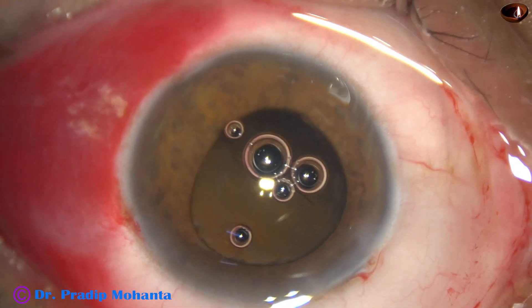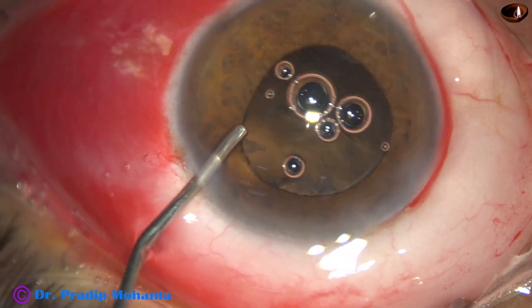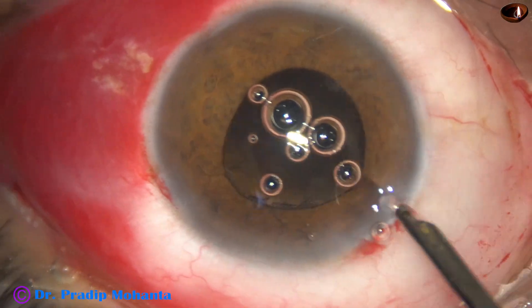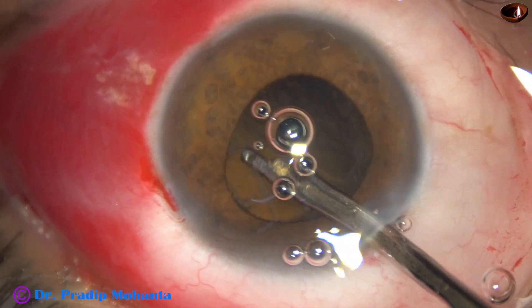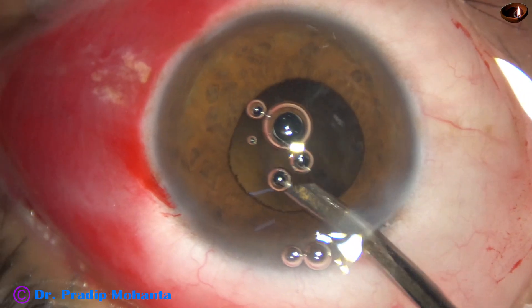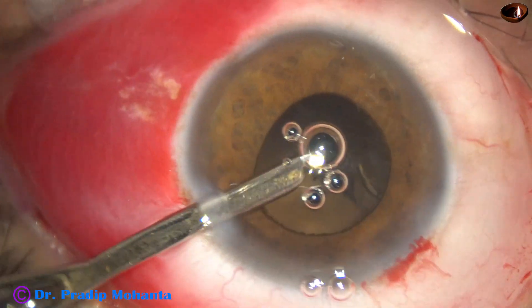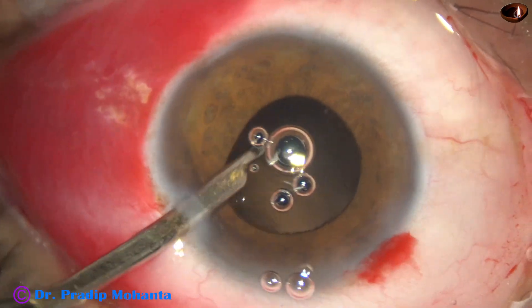The nucleus is managed. Now inject some visco and use a 23G Simcoe for removal of the cortex. Cortical clean up is done.